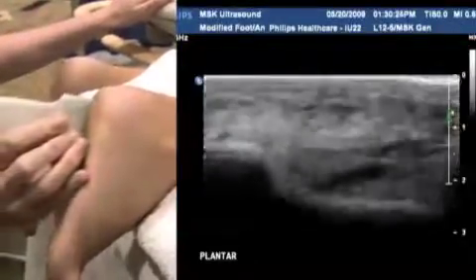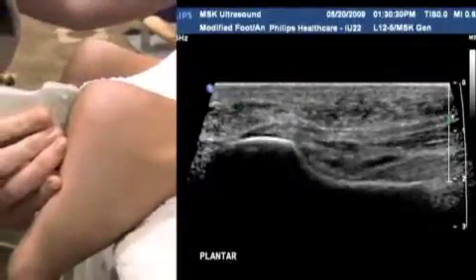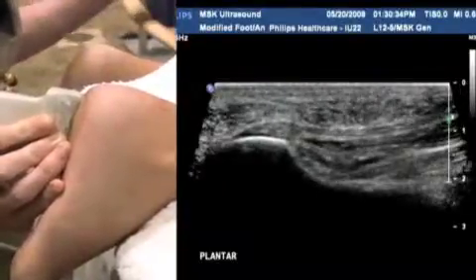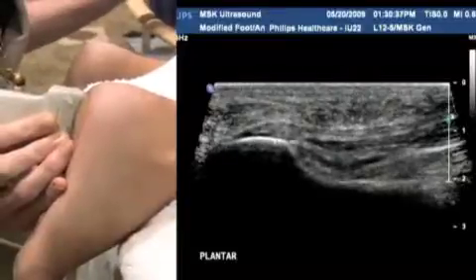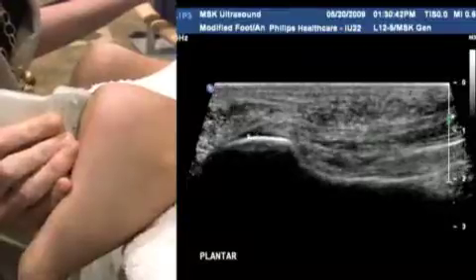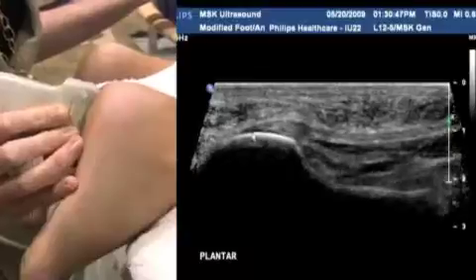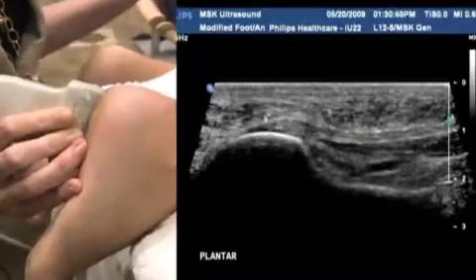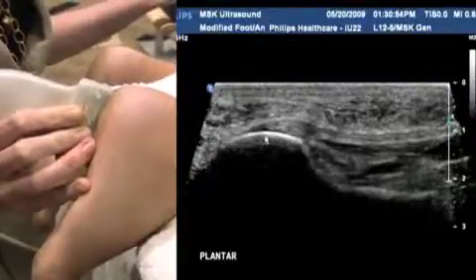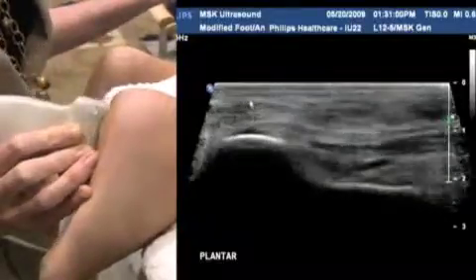So again, just going back to a sagittal section over the calcaneus, again pushing out into wide scan just to get that extra amount of information either side of the perpendicular. Again, beautiful looking plantar fascia here. Attachment here normal. Again, you can see the anisotropic effect of this very proximal portion of the plantar fascia as it attaches onto the calcaneus. But you can see as you heel toe back and forth that fills in and becomes echogenic. So you can see that that's perfectly normal, and that hypoechoic area is just artifactual in this case.